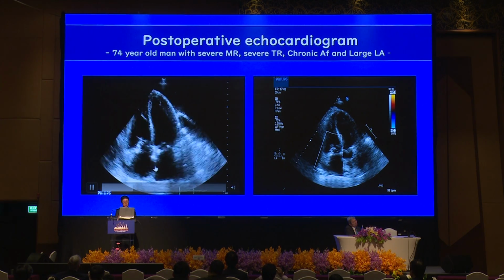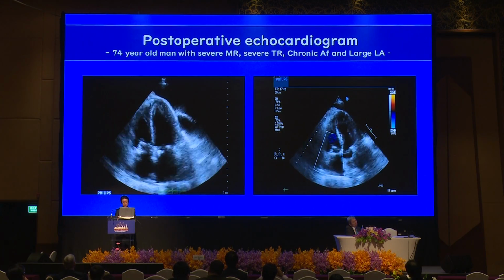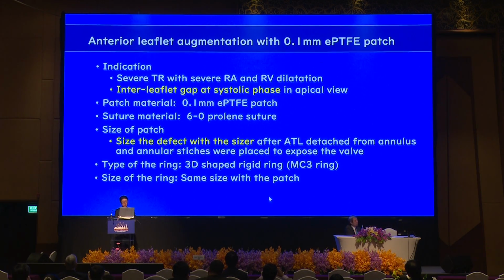This post-op echo showed the TR is well controlled. The indication of this technique is an interleaflet gap at systolic phase in a preoperative echo. The patch material was a 0.1 millimeter EPTFE patch. I used 6-0 Prolene sutures.